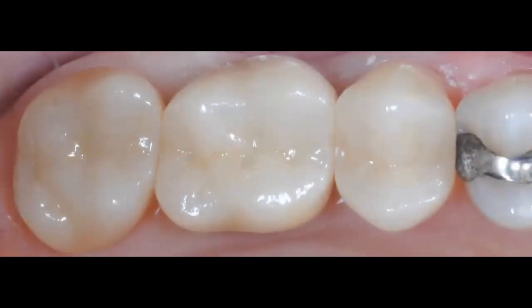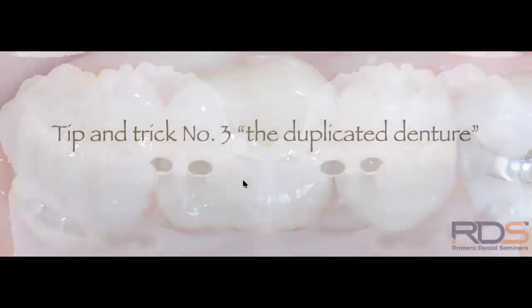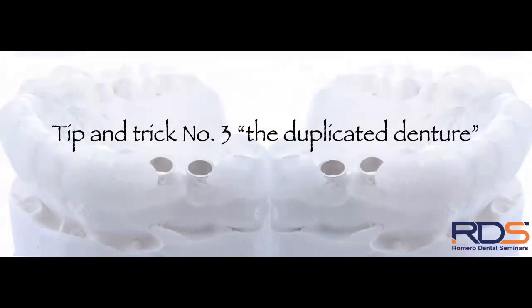And then finally, we deliver all these 3 restorations. We cement them, and we're good to go. Patient is ready to enjoy that new tooth that is now held in place by an implant. And this will take us now to our third tip and trick of the day, which is the duplicated denture.